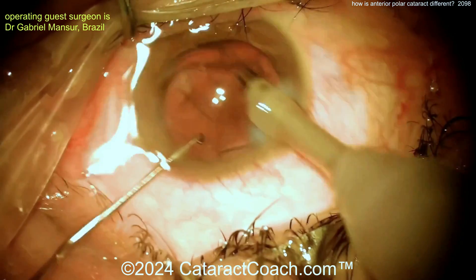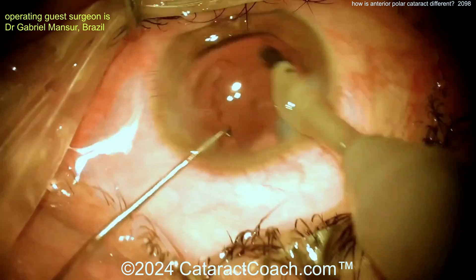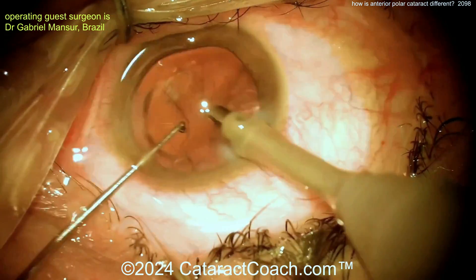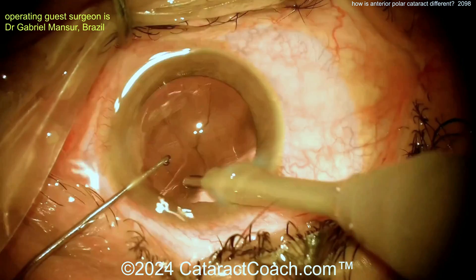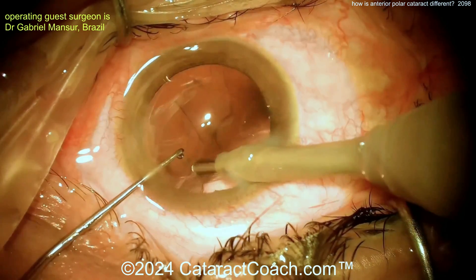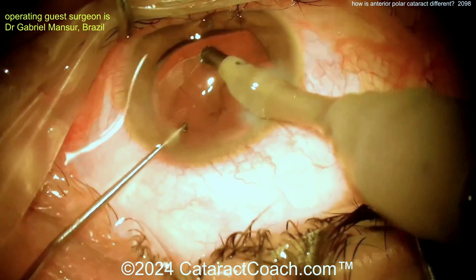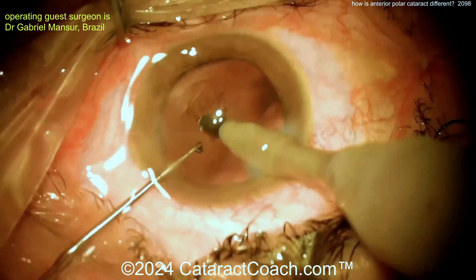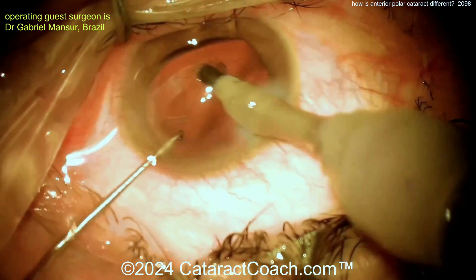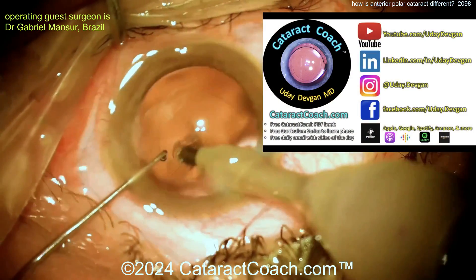Normal cortical cleanup. You don't expect any posterior capsule issues here — the posterior capsule should be nice and strong and healthy. At this point I would switch to the I&A probe, but certainly if you're a very experienced surgeon, you can remove cortex here with the phaco probe — just be careful. And nicely done here, cleaned up pretty nicely.